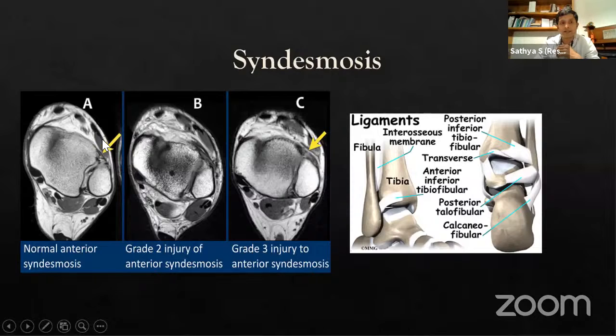And anterior to that, you're able to see the extensor hallucis and the extensor digitorum brevis. In front of that, you're able to see the extensor digitorum tendon, and then the tibialis anterior tendon here. And medially, we are able to see part of the deltoid area attaching here. Okay, and you are able to see the medial malleolus. This is part of the medial malleolus. This is the plafond of the tibia.